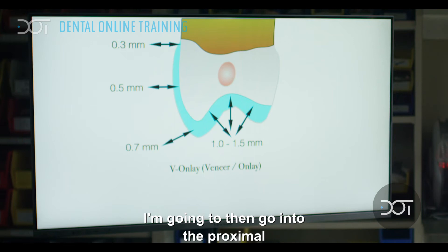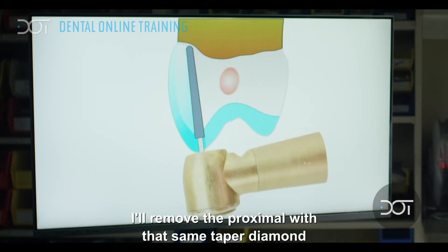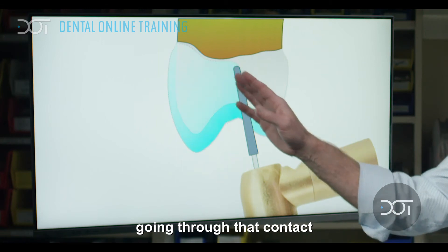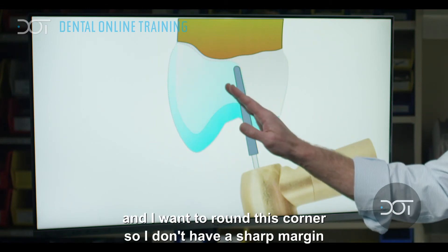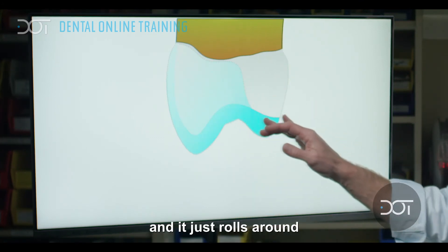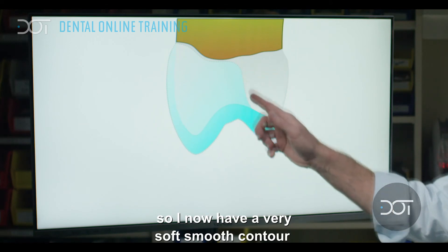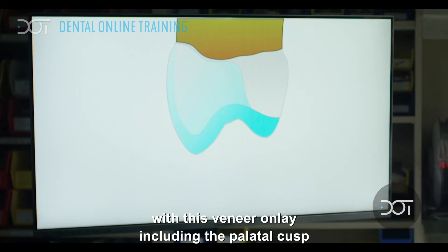I'm going to then go into the proximal and remove it with that same tapered diamond. Going through that contact, I can now just lift up this burr and round this corner so I don't have a sharp margin — it just rolls and rounds. So I now have a very soft, smooth contour with this veneer onlay hooding the palatal cusp.